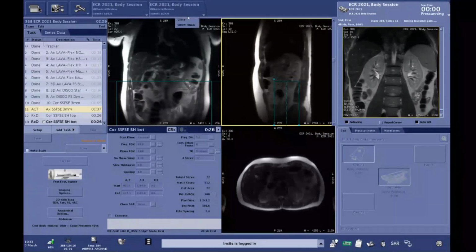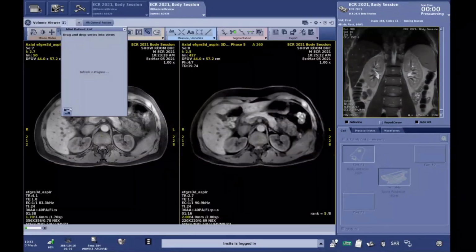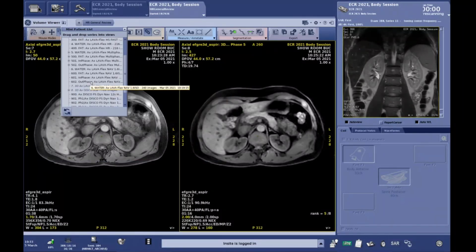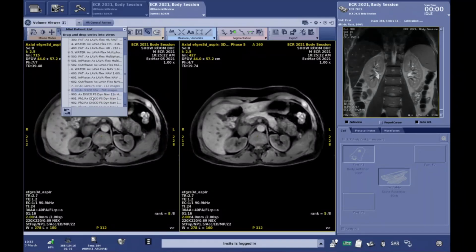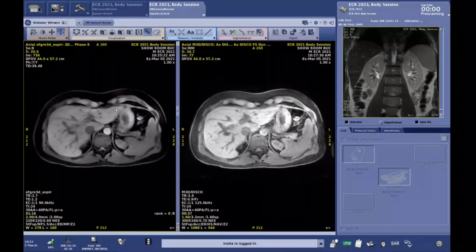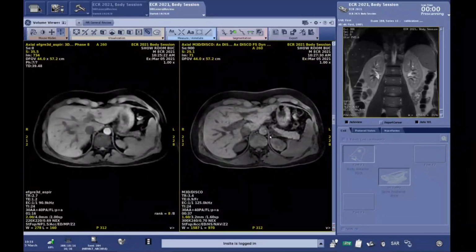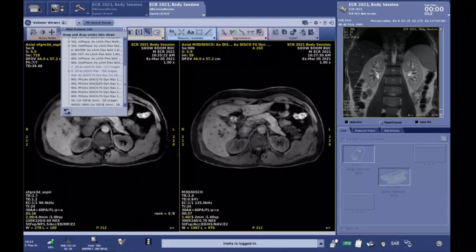Absolutely. Let's just maybe finish the last acquisition we did for the dynamic one, and then we will move to the SSFSE we already acquired. So we said we have the DiscoStar, the dynamic technique with 6 seconds of temporal resolution. I will maybe load the dynamic one.